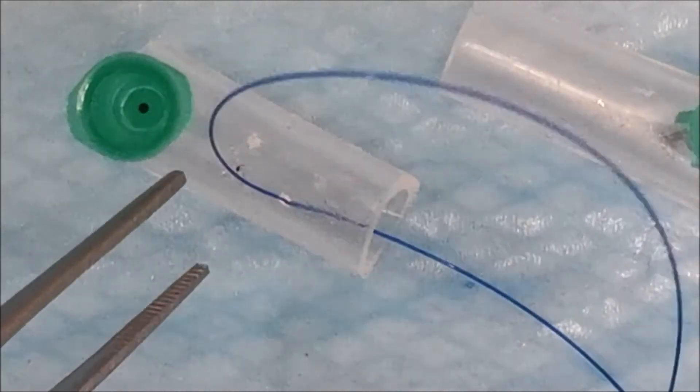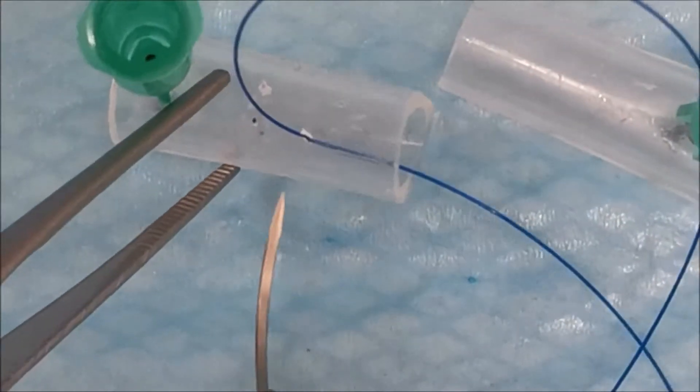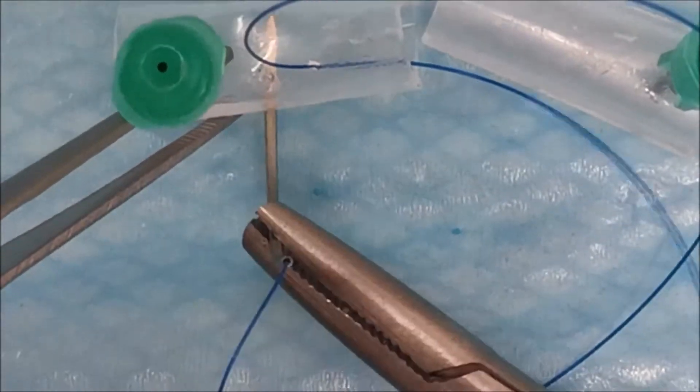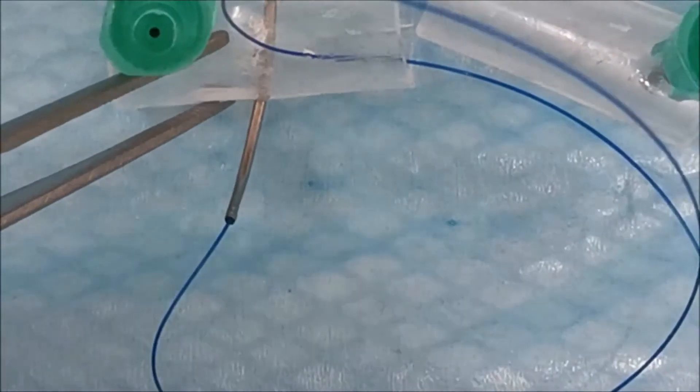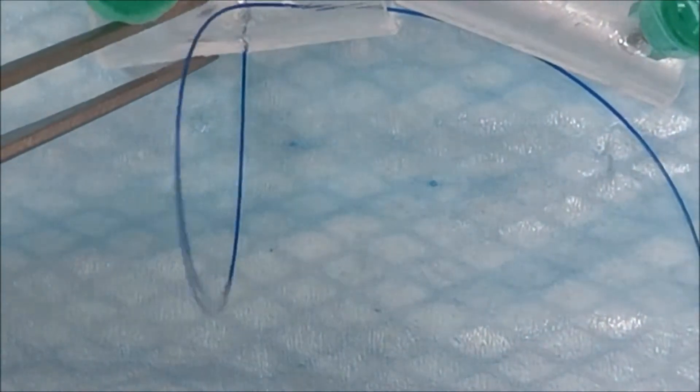Common errors experienced during the tendon repairs are, firstly, when you do a modified Kessler or a cruciate and you do your transverse suture like this.